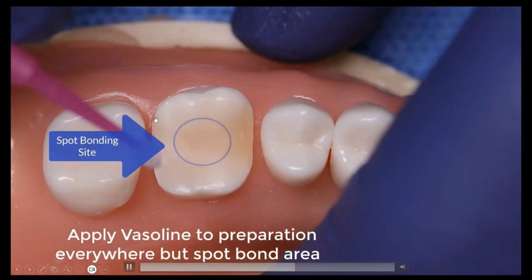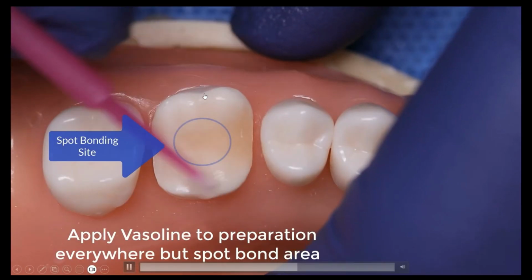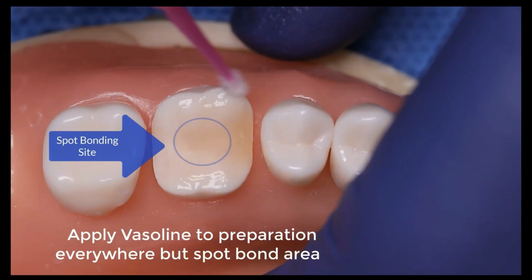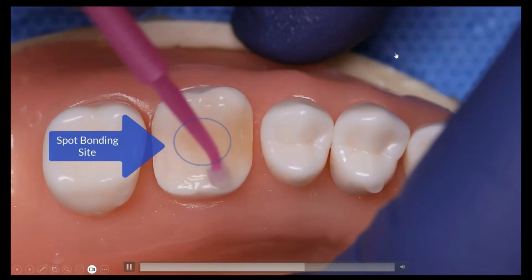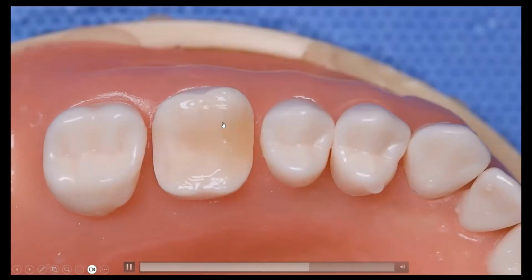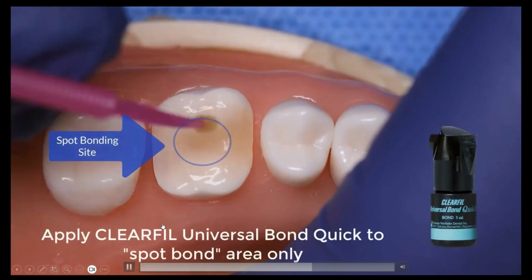You're going to apply liquid Vaseline to the outer area of the tooth. Keep in mind, the tooth is completely sealed. The dentin is completely sealed. So you're not going to have any problems with bacteria infiltrating or causing a problem with the pulp. So we're going to keep this spot bonding area in the middle, our eye on that.